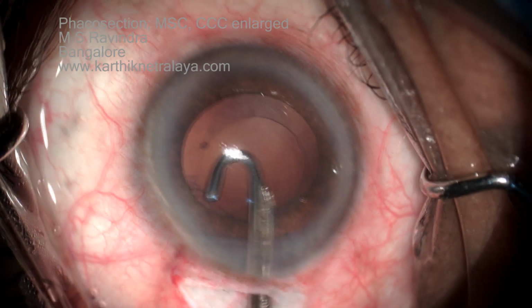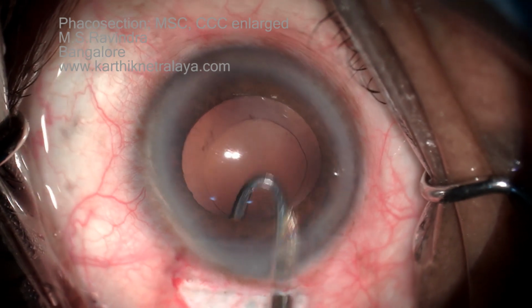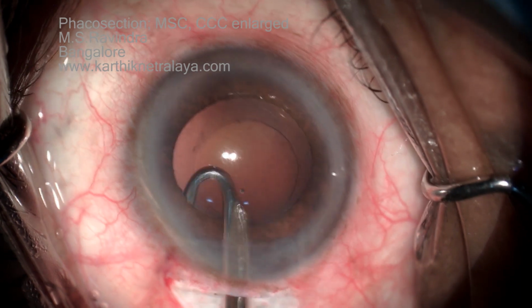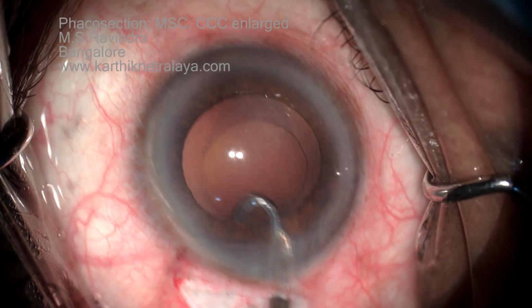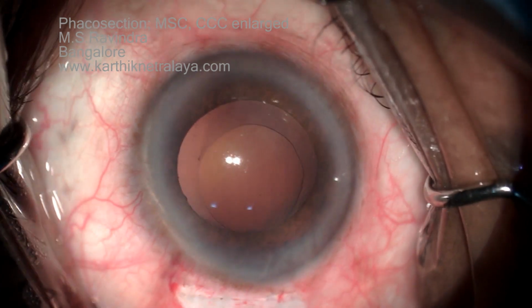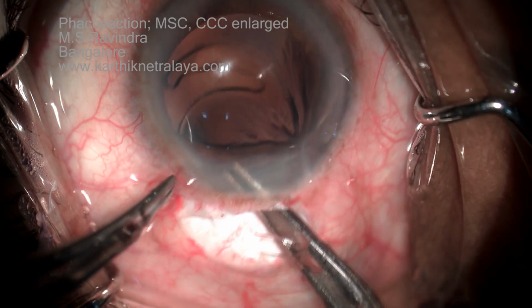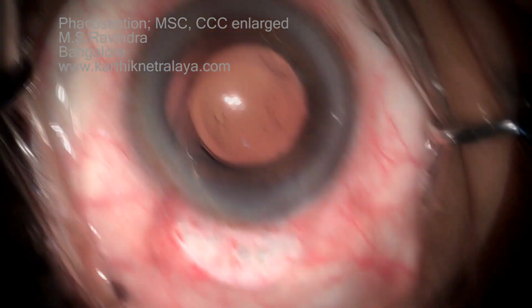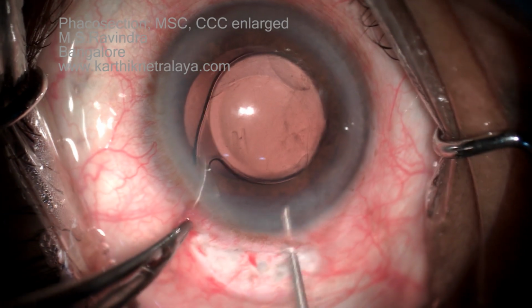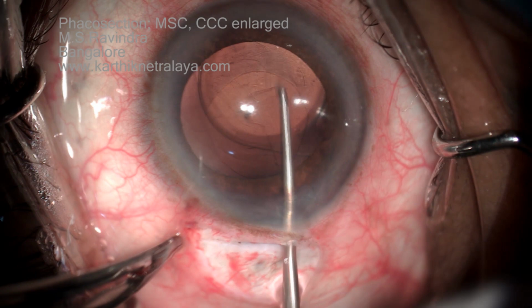The anterior capsule is polished and the visible cellular layer of lens epithelial cells is aspirated into the port. No side ports are needed for this technique. The lens does not have to be folded; its virginity, its neatness is maintained because it's not folded and pushed through a small injector cartridge.